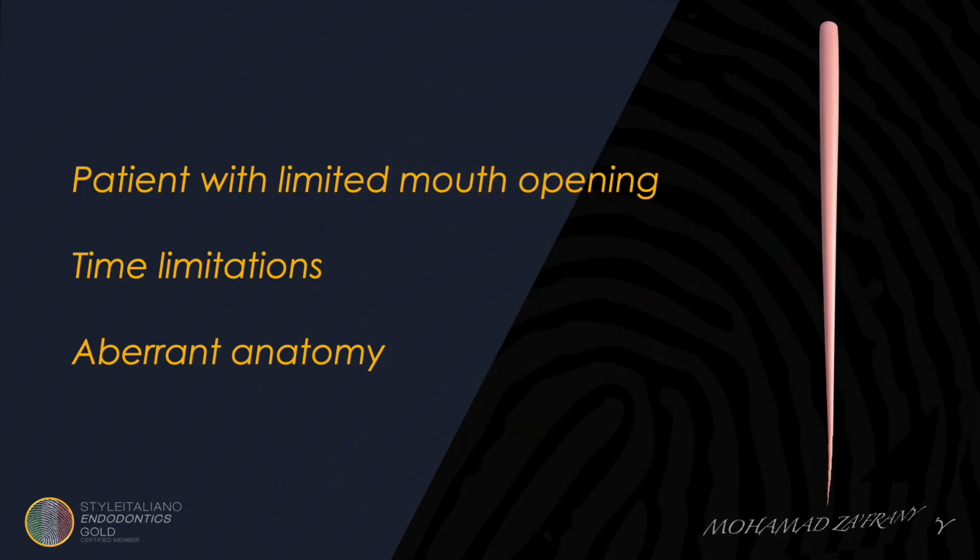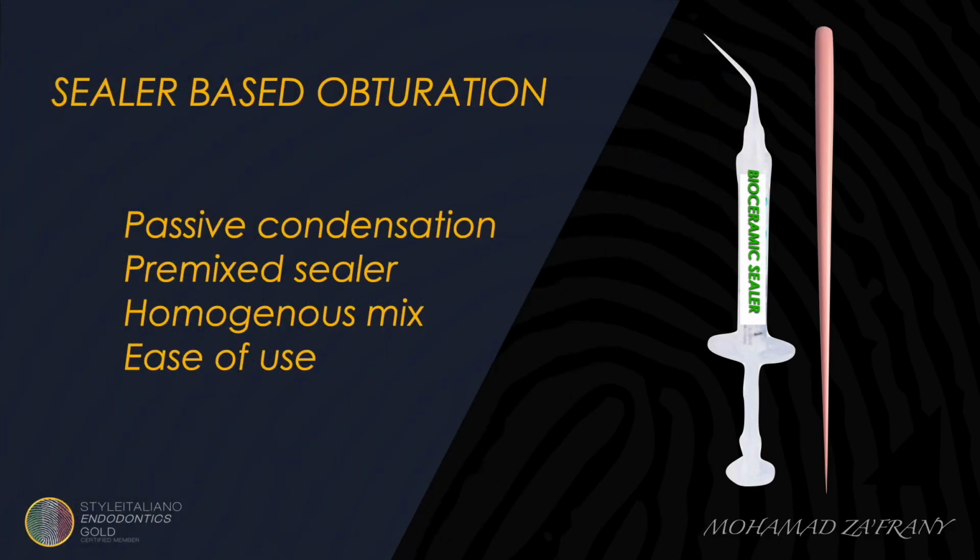The sealer-based obturation technique became a widely used technique globally. It's also called sealer-dependent obturation because mainly we depend on sealer to fill spaces. We use gutta-percha cones as a plunger to push the sealer into the space for three-dimensional filling and also to facilitate the treatment, acting as a core for filling removal.